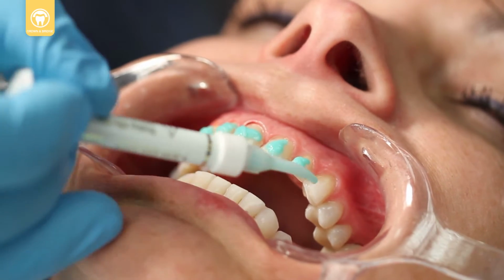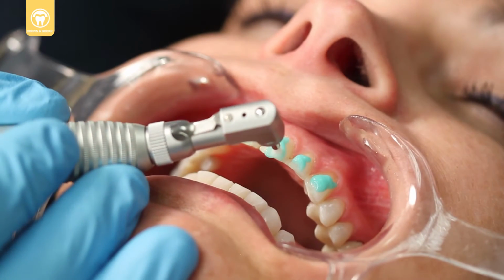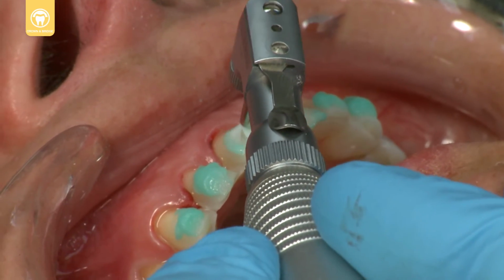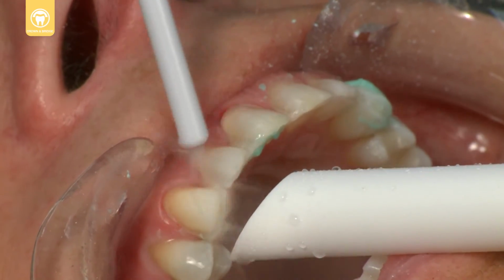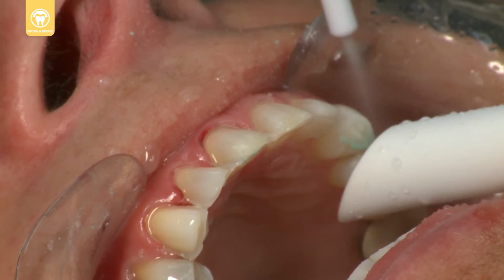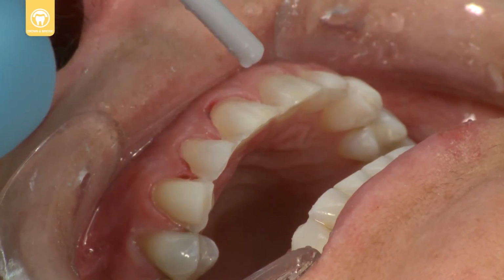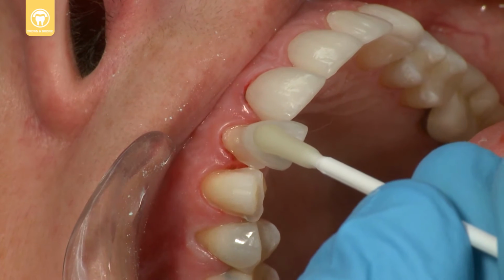Clean and disinfect the preparations with Concepsa scrub to remove residual temporary cement. Rinse and air dry the preparations, then verify the prosthetic fit.